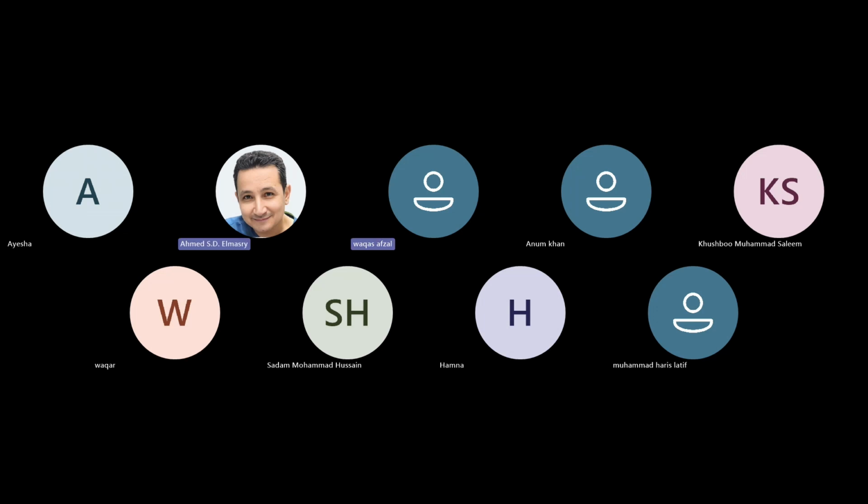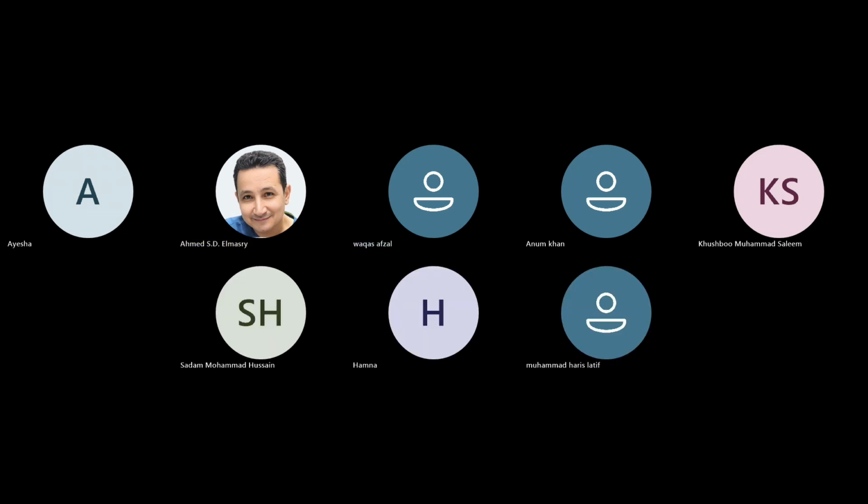So, is there a role of balloon position in this? I'm not sure there is a relation with the balloon position, but it will affect the augmentation more. The timing will be normal. Okay, it could be normal, but the augmentation might be affected, for sure. Yes, of course, the position. But if you have early inflation, it's a timing issue.